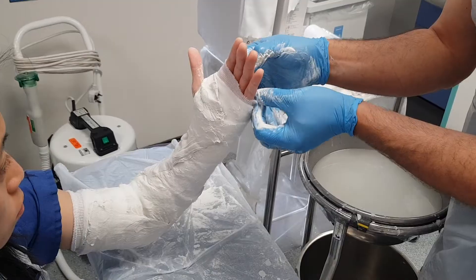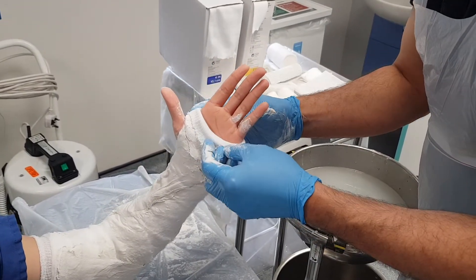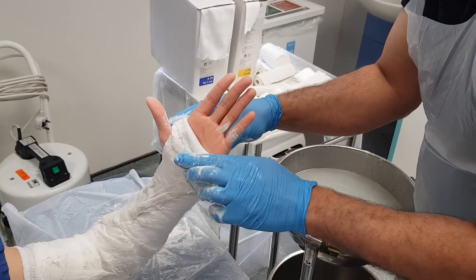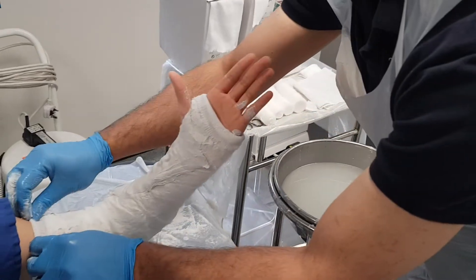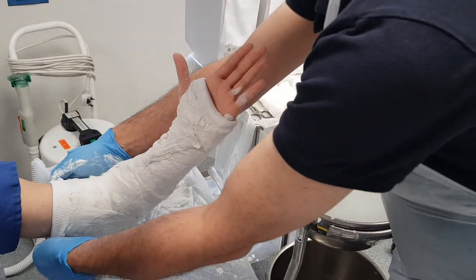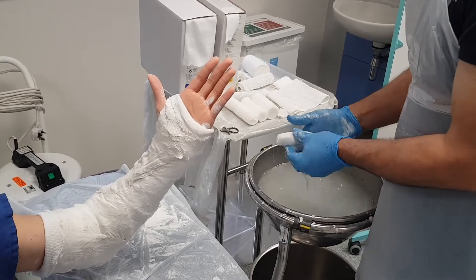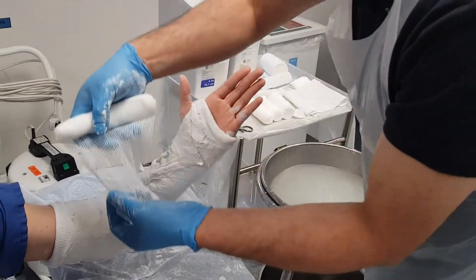So now I've got my U-slab. I'm going to roll back the stockinette and the wool to cover the sharp edges at the end of the back slab. And then I'm going to wet the stockinette and apply it over the top.